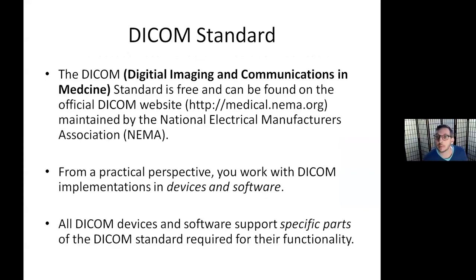The DICOM standard is free, and it can be found on their website. You can download it. It's book length, and it's maintained by the NEMA, National Electrical Manufacturers Association. From a practical perspective, you work with DICOM implementations. And again, I'll get into exactly what DICOM is. I've only told you what the word is, but you'll see exactly what it is.